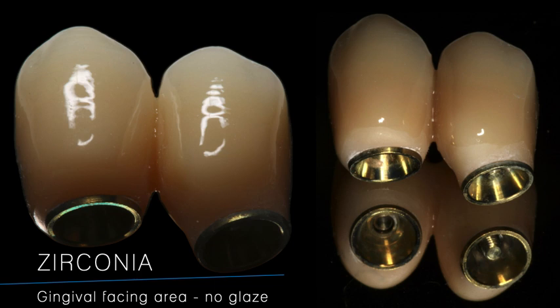Well, I've finished this case with 2 splinted crowns, okay, and you can see that the zirconia in every place it touches the gingival area, it's not glazed, and this is fundamental.